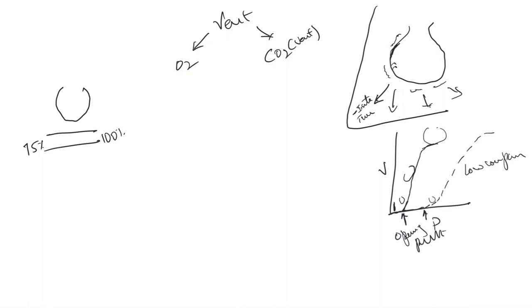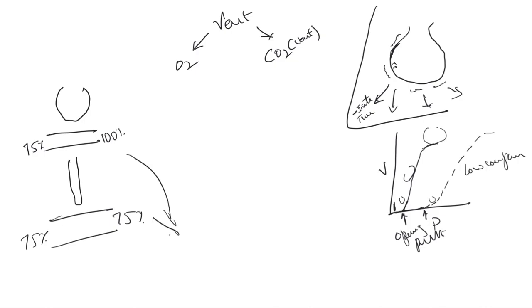Because if you have an alveolus that is completely collapsed, your blood is going to reach the alveolus at 75% and it's going to exit at 75%, and you can give all the FiO2 you want. You can't improve the oxygenation because it can't get through. It's going to mix with the 100% and decrease the SAT. But we also set an FiO2. How does increasing oxygen work then? It shouldn't really work, right? Because we are not thinking quantitatively.